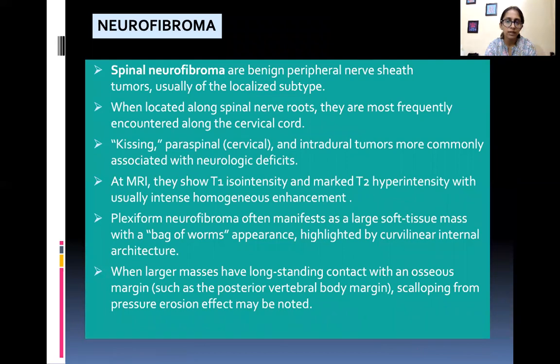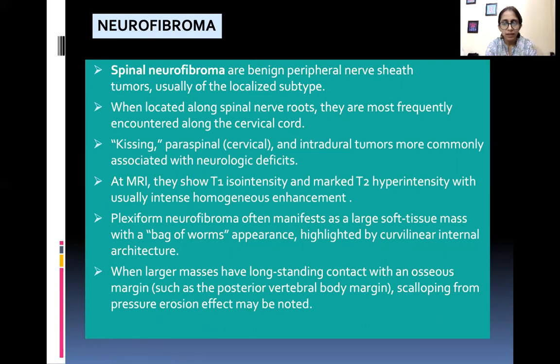Spinal neurofibromas are benign peripheral nerve sheath tumors, usually of the localized subtype. When located along spinal nerve roots, they are most frequently encountered along the cervical cord. At MRI, they show T1 iso-intensity and marked T2 hyper intensity with usually intense homogeneous enhancement. Plexiform neurofibroma often manifests as a large soft tissue mass with a bag-of-worms appearance highlighted by curvilinear internal architecture. When larger masses have long-standing contact with an osseous margin such as the posterior vertebral body, scalloping from pressure erosion may be noted.